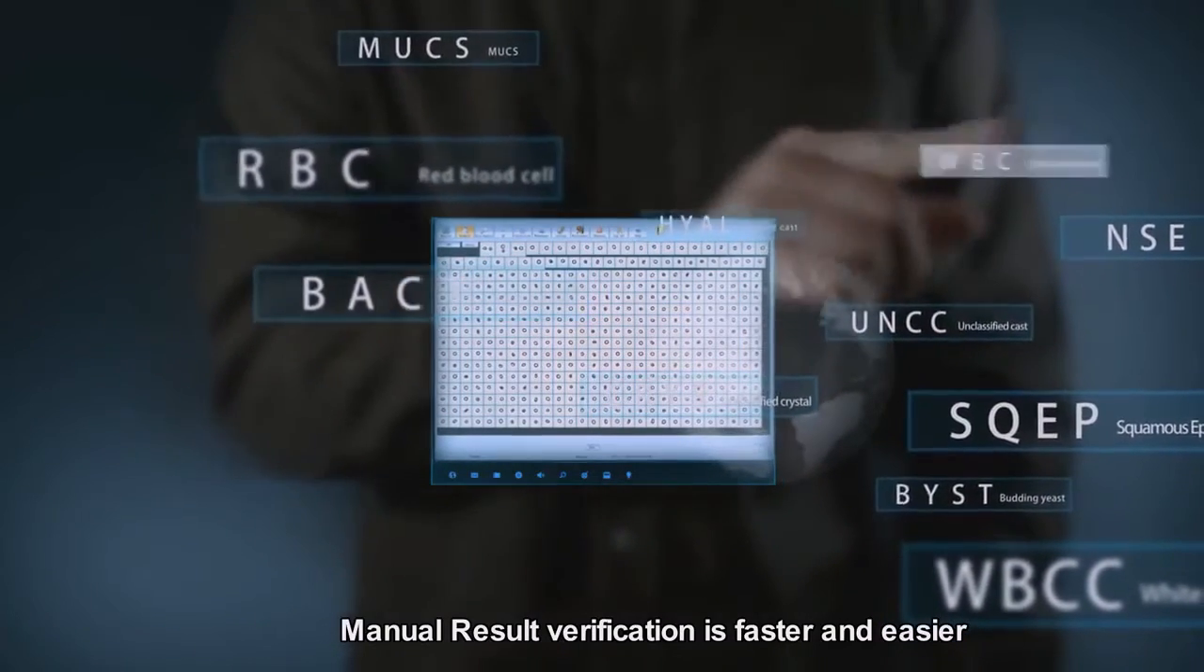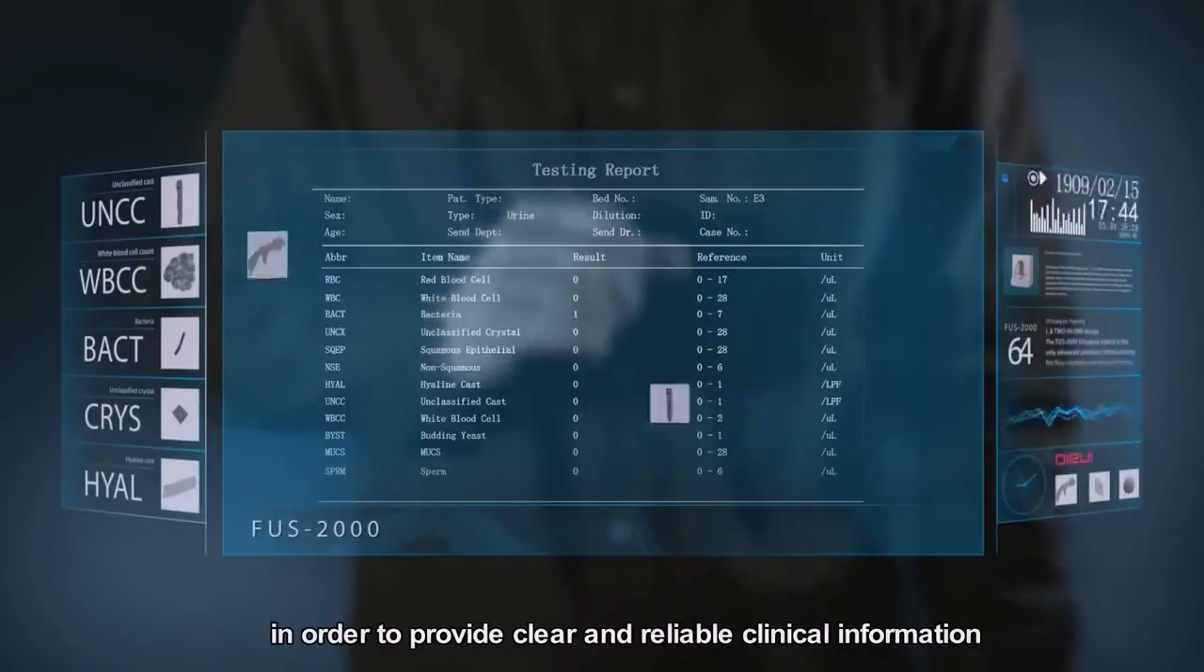Accurate test results. Real sediment images ensure urine-formed elements can be easily identified and verified. Manual result verification is faster and easier with real images generated through advanced software morphology identification technology. Result reports integrate information and images in order to provide clear and reliable clinical information.